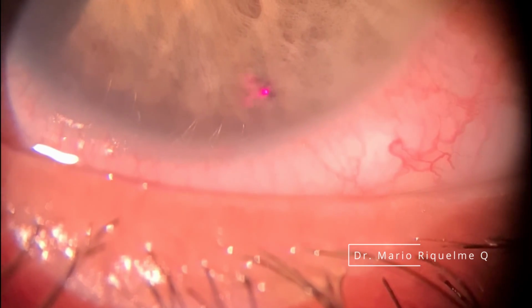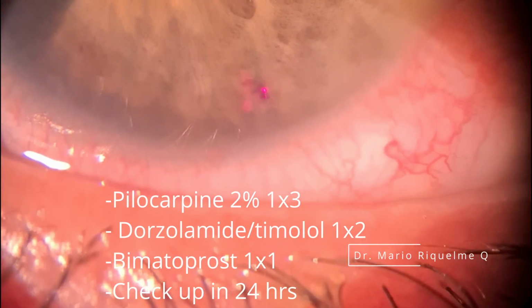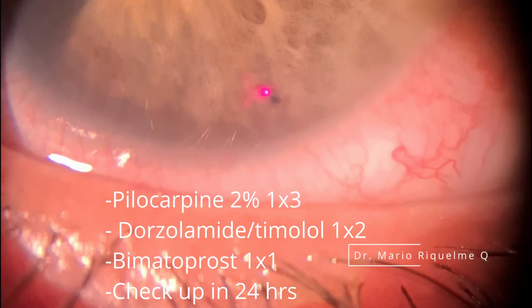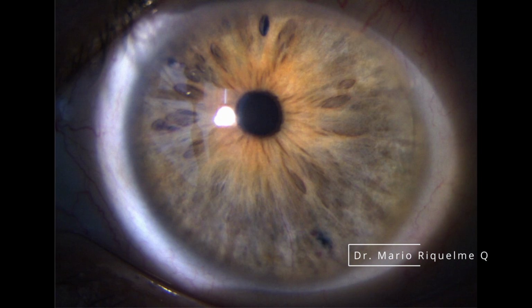So we went ahead and did a peripheral iridotomy right there on the spot. We put the patient on Pilo, a combination of dorzolamide and timolol, and bimatoprost at night, and we called him back for a checkup the next day. We did 3 iridotomies. It works better for me if I do more than one in these cases.